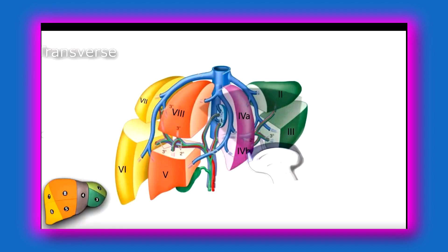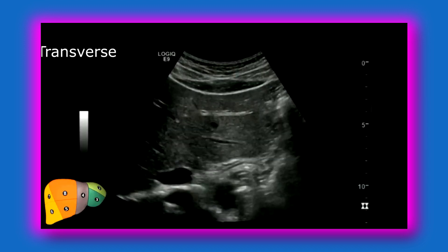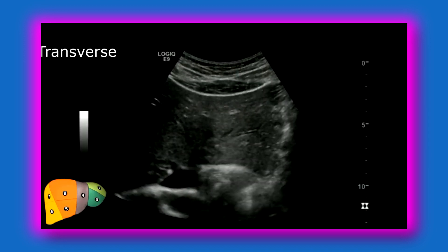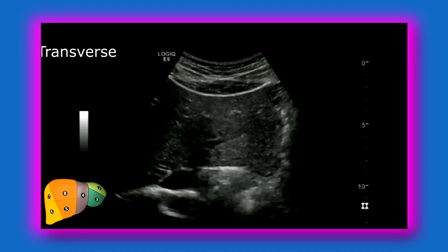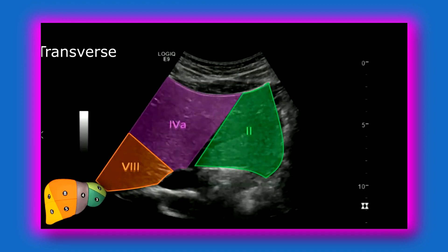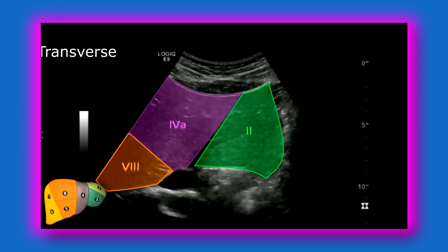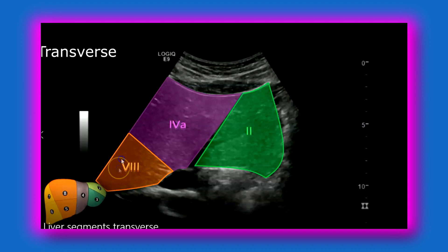In transverse, these are the superior segments of the liver — segment 2. You'll see you have segments 2, 4A, and 8. We're in the superior segments, scanning around this region, so 2, 4A, and 8.